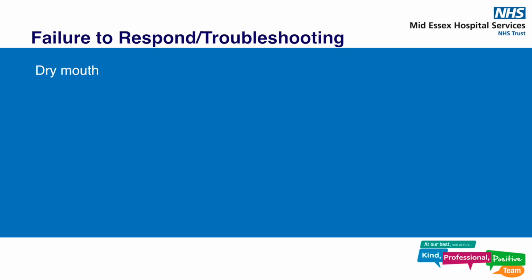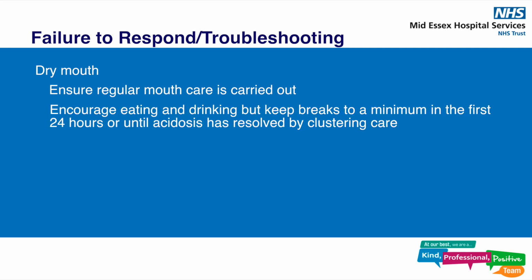If the patient reports a dry mouth, ensure regular mouth care is being carried out. Encourage the patient to eat and drink, yet try to keep breaks to a minimum in the first 24 hours or until the respiratory acidosis has resolved by clustering care.